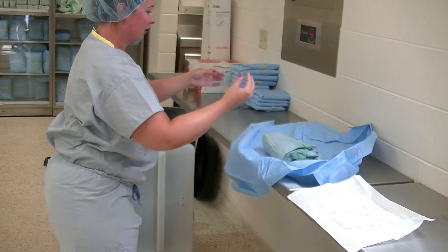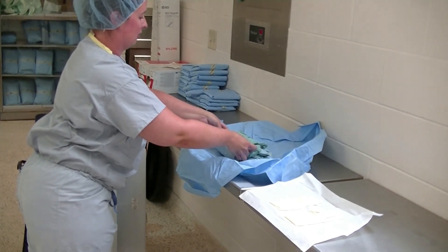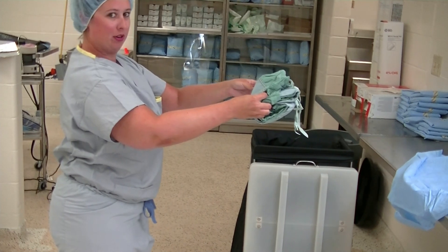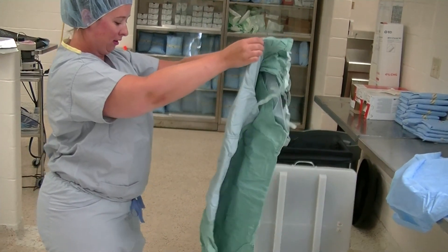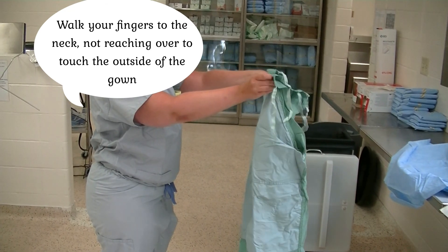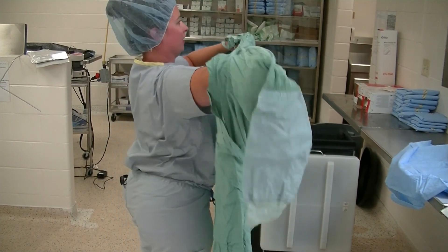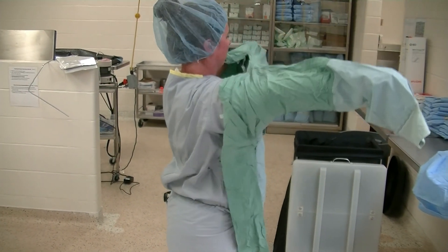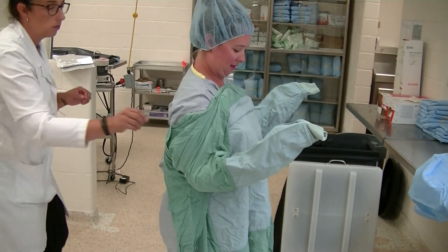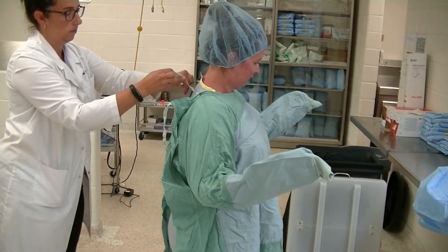Next we're going to gown. Come in, pick up your gown, and back away from your space so that you have room to open the gown. Stay up near your neck and dive your arms into the sleeves. Then have your assistant tie your gown.